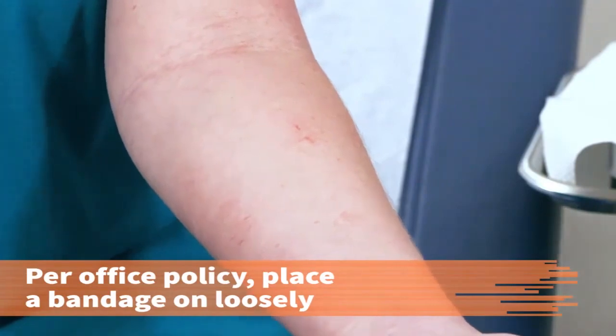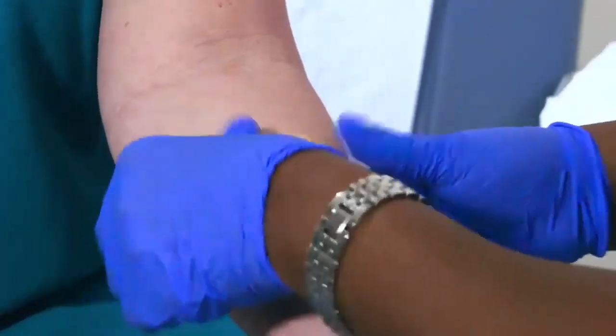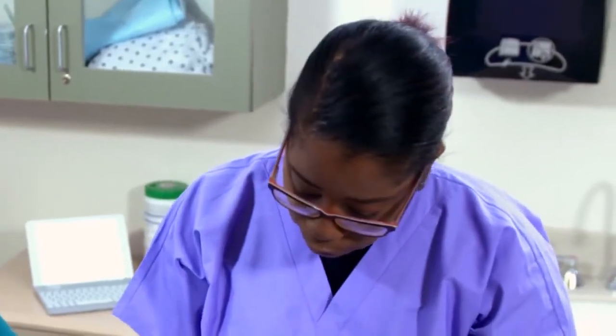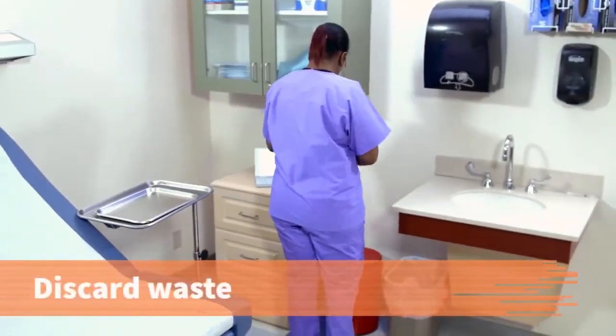Offer a bandage. Place the bandage on very loosely to just absorb any blood from the site. Some offices will not allow the use of a bandage. Observe the patient for any adverse reactions. Clean up the area. Discard all waste in the biohazard waste container.